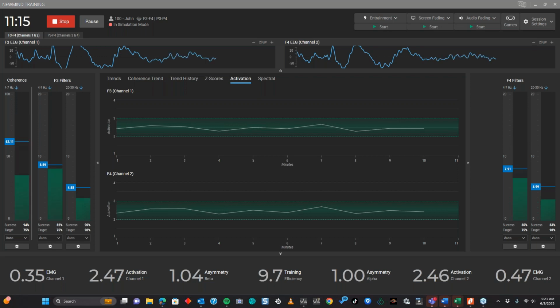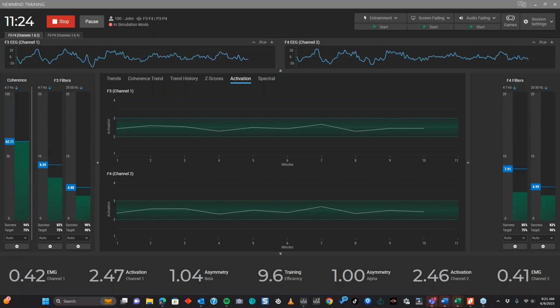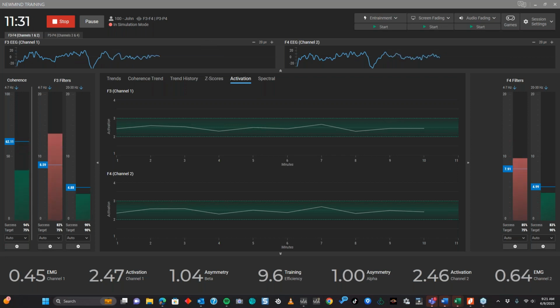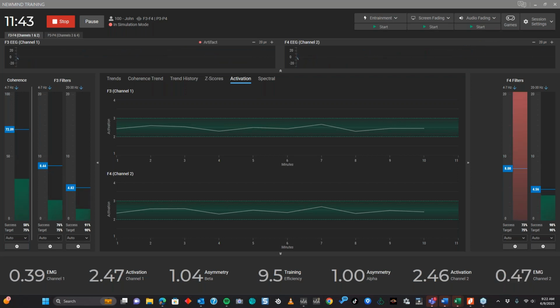The kid's map initially presented with a bunch of excessive delta, theta, and alpha. The database recommended protocol 3, and the clinic ran roughly 60 sessions using protocol 3 in different locations. The end outcome is that the post-60-session map showed pretty much no change. Two factors created this problem.